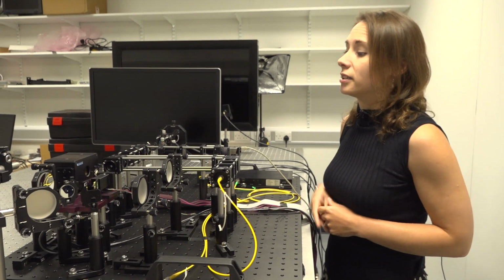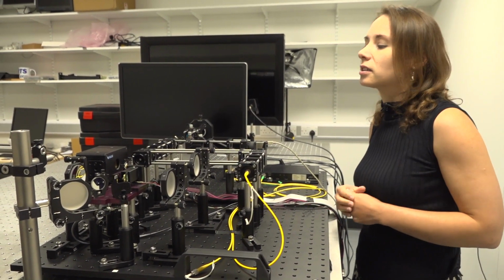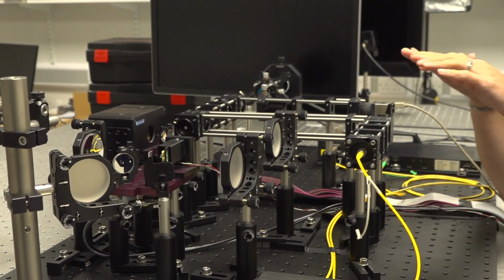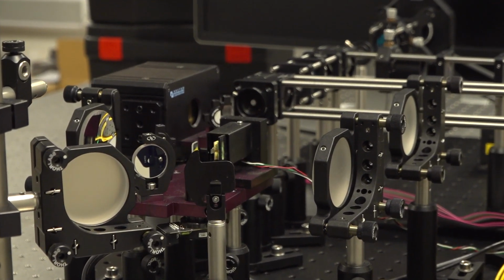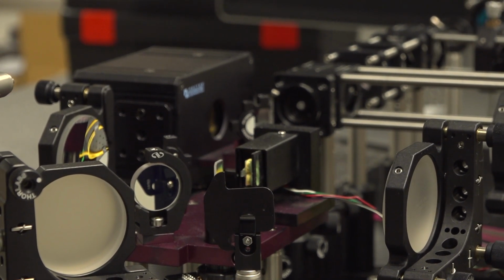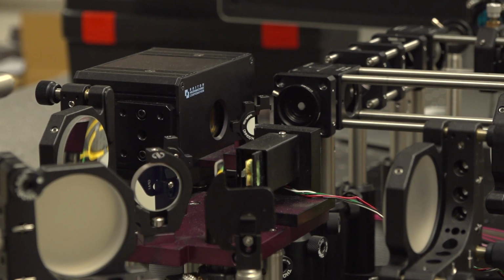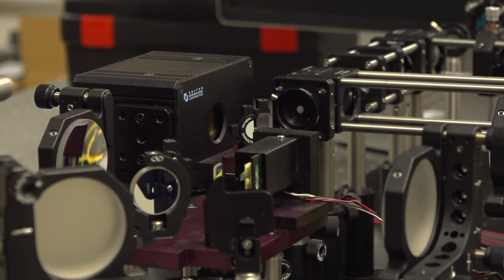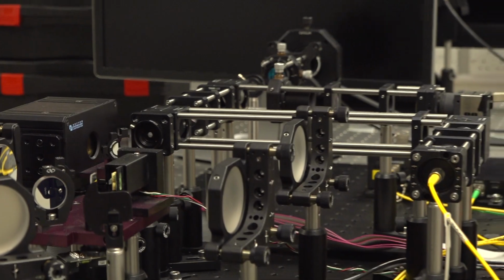One of the key components in this system is this deformable mirror. This is what allows us to see these really tiny cells at the back of the eye. This mirror has lots of small actuators behind its surface, and these actuators push and pull to change the shape of the mirror surface. By measuring the optical distortions in the eye, we can calculate the shape that this mirror needs to have to cancel out those optical distortions, allowing us to recover a very detailed picture of the back of the eye.